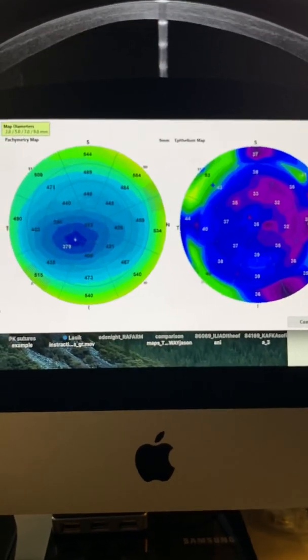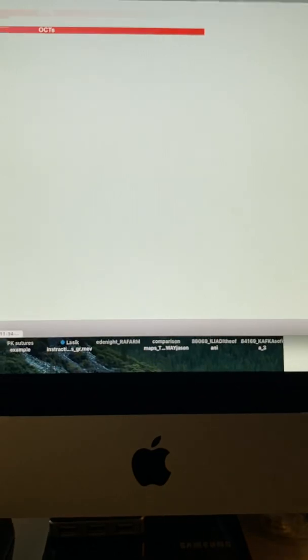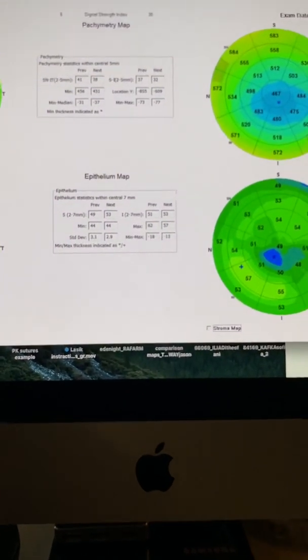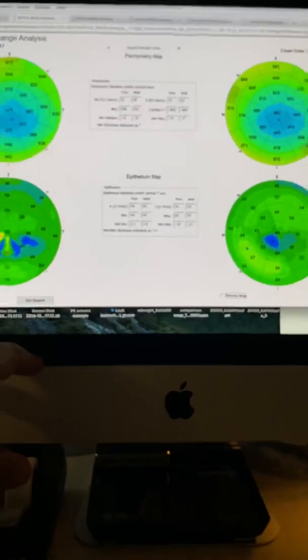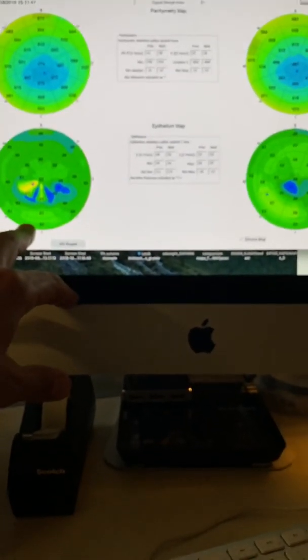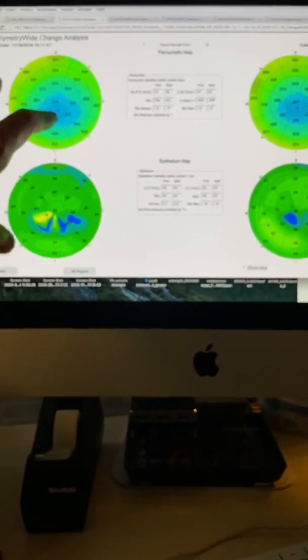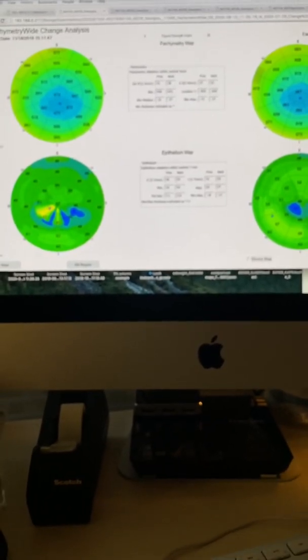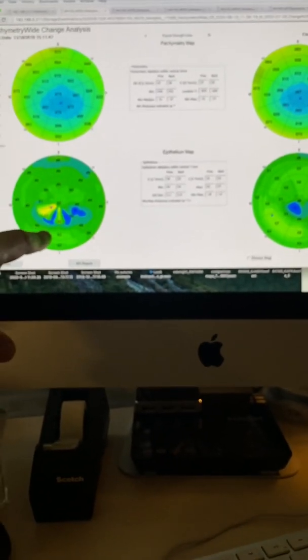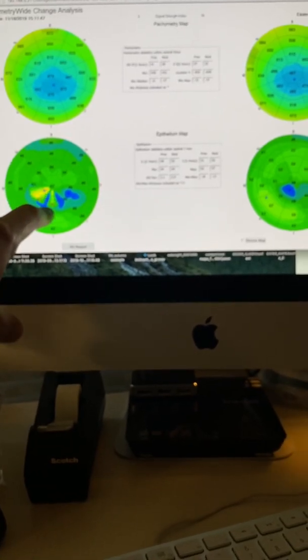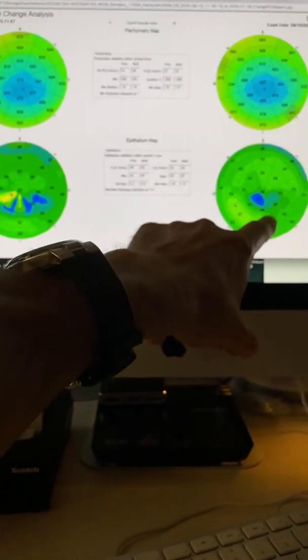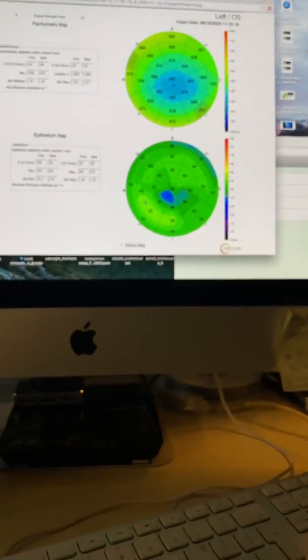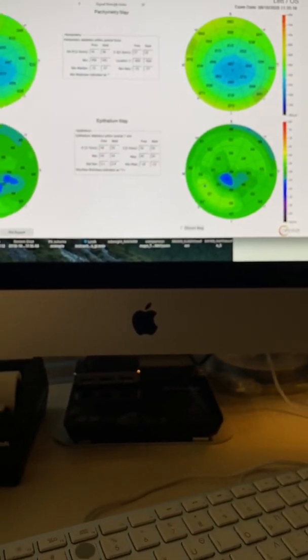Let's go back and look at the other eye. The other eye is uninvolved currently, but we're going to follow very closely the epithelium maps on the other left healthy eye. Because although he's 20/20 in that eye and his topographies are not bad, you can see that the epithelium dynamics reveal that the cone here is active.